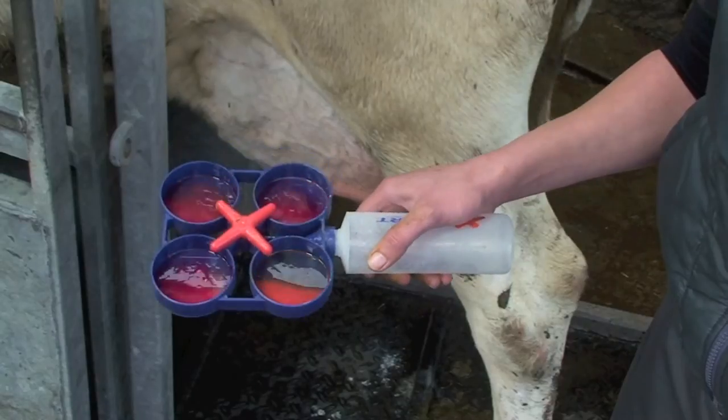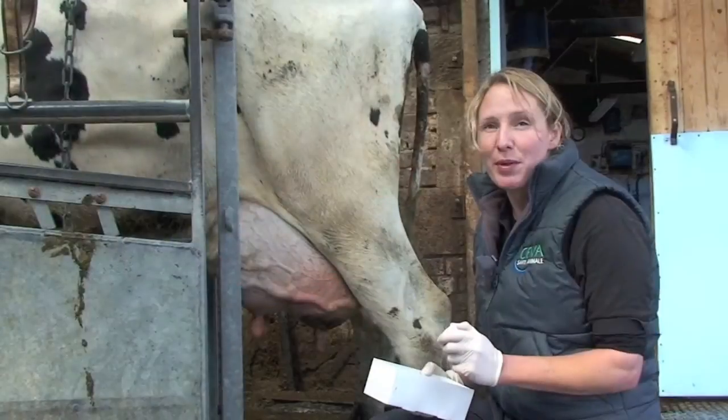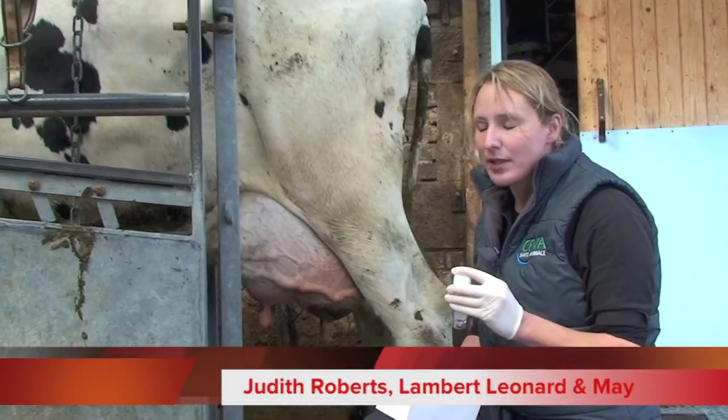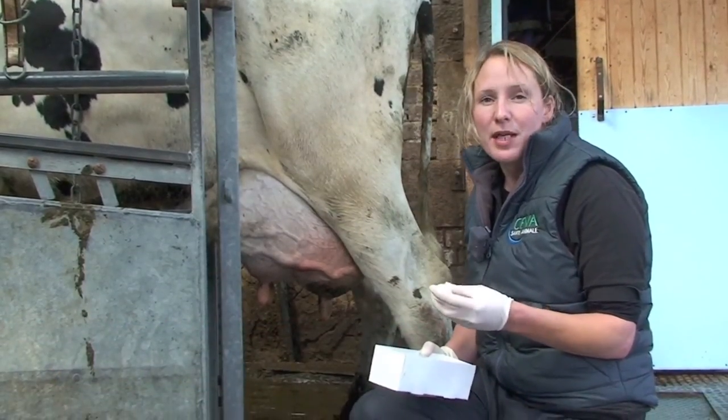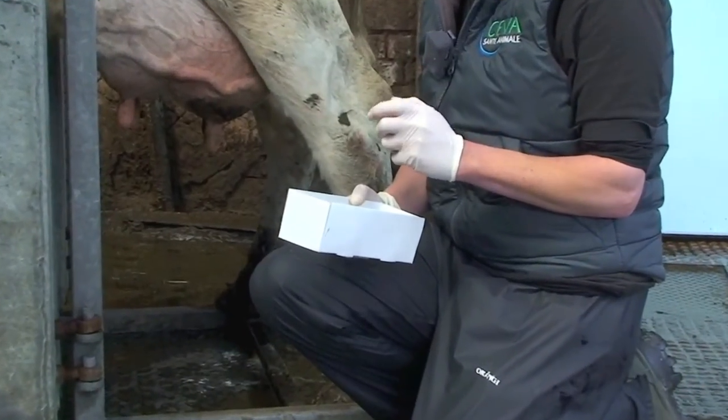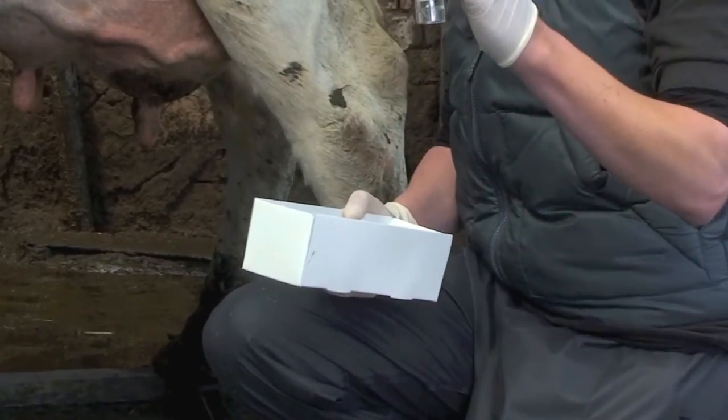We have our cow that's tested positive on one of the quarters when we performed a CMT. The next thing we're going to do is take a sterile milk sample, because we're going to send it away for some bacteriology, or it might be that we're going to put it in the freezer and store it for when we next need it.